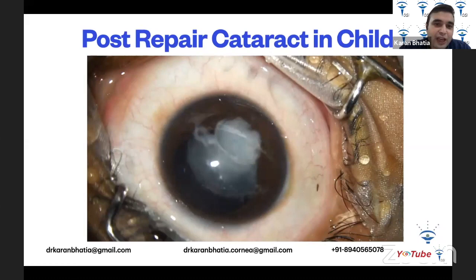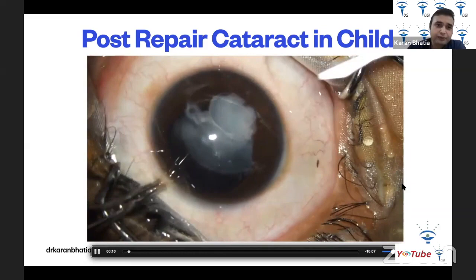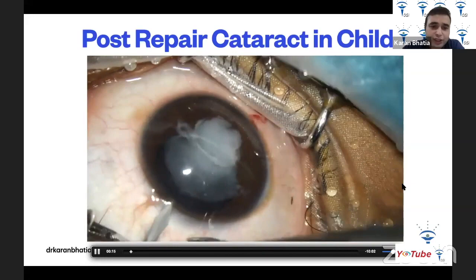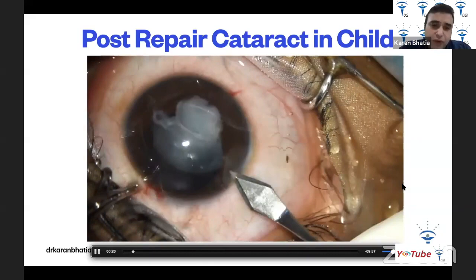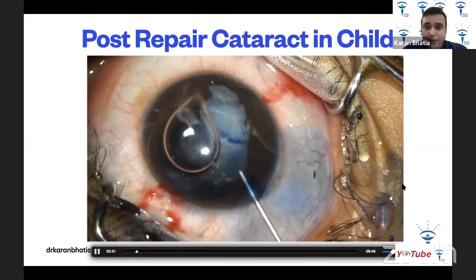This is another case from last month — a child who had a traumatic cataract, with the tear already repaired. Two side port incisions are made with an MVR knife, followed by a clear corneal incision using a 2.8 keratome. The anterior capsule is stained with trypan blue to get a good idea of whether it is breached. OVD is injected into the anterior chamber, and the fluffy, swollen lens matter is removed.